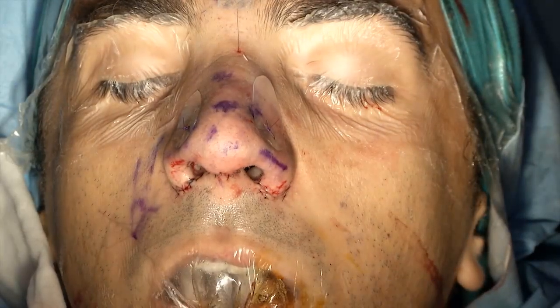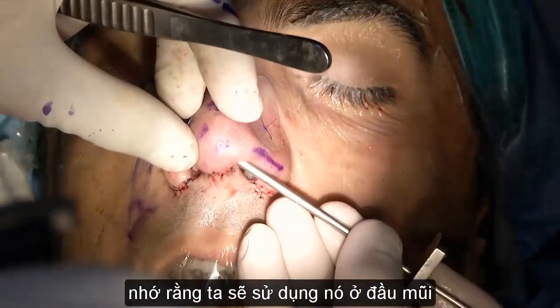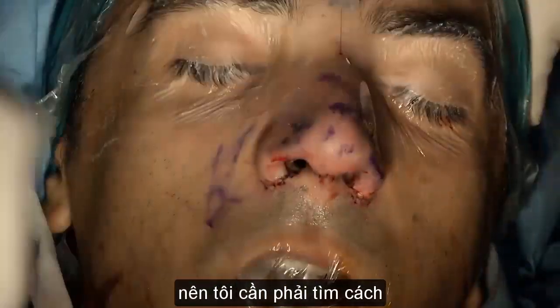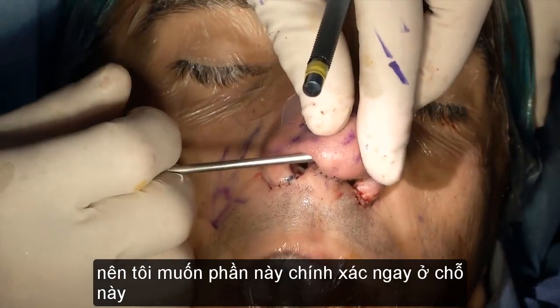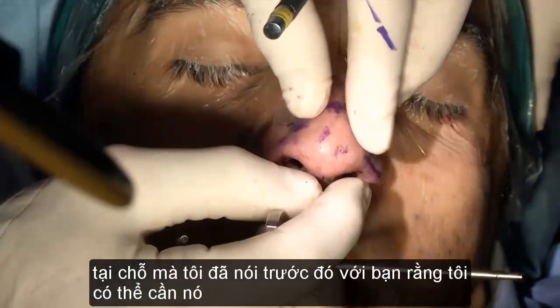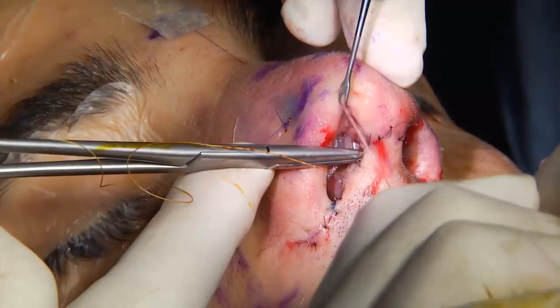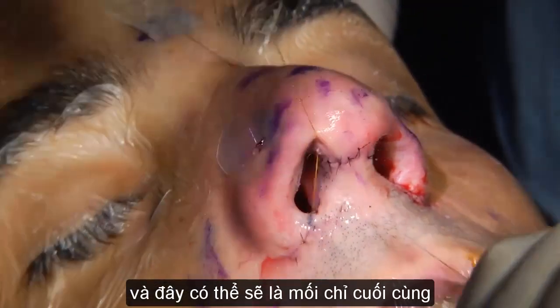Now, last DC bit, remember we wanted to use it at the tip. So I have to find a way, you're losing the thread. So I want this thing exactly here, where I told you before I may need it. And this is going to be my final stitch.